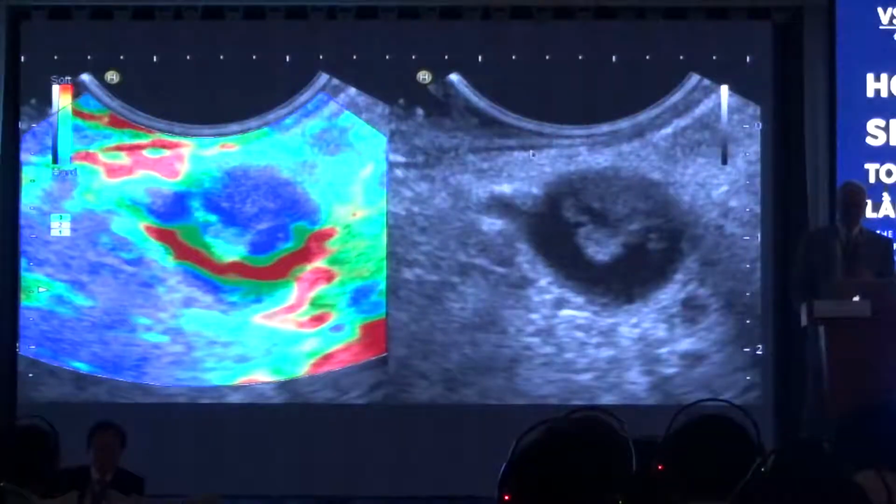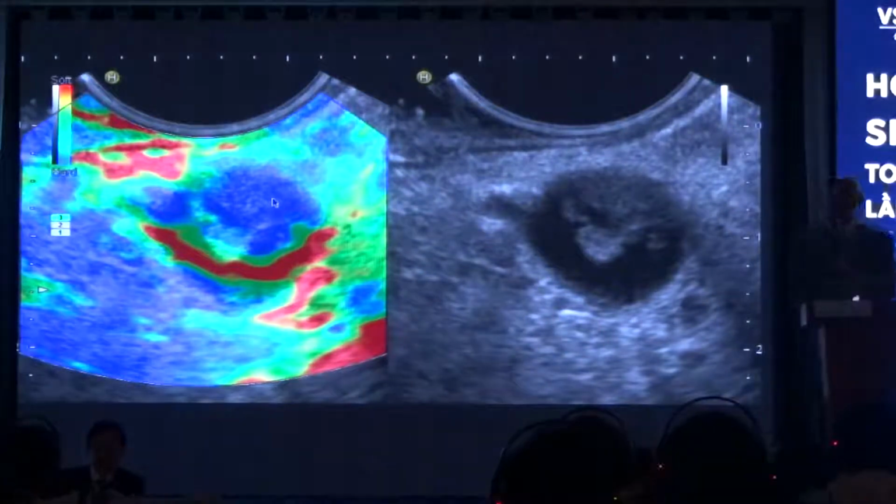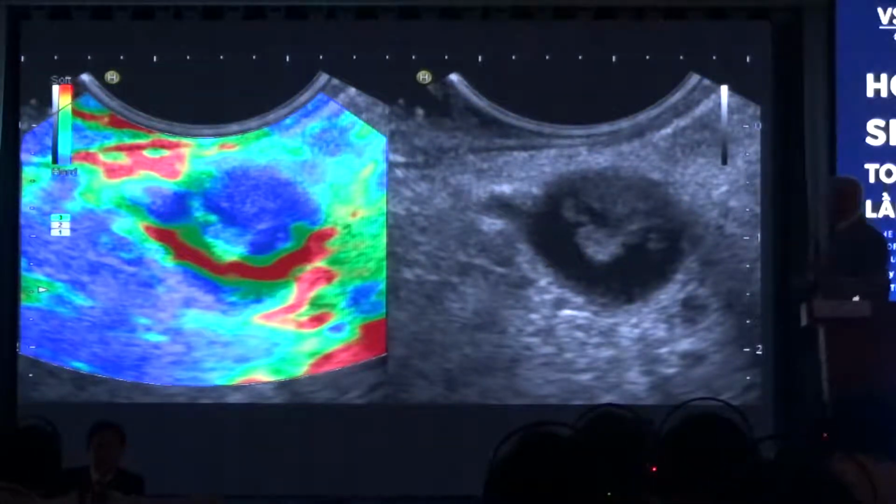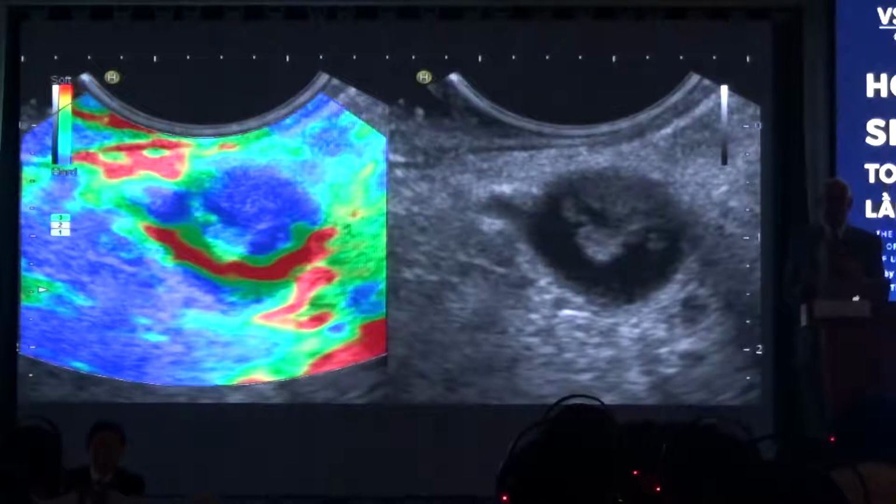But also, elastography can show the stiffer elements of a very tiny biliary neoplasia, which hasn't even been seen by MRI, next to the papilla. This is endoscopic ultrasound with best resolution in that very small respective field.